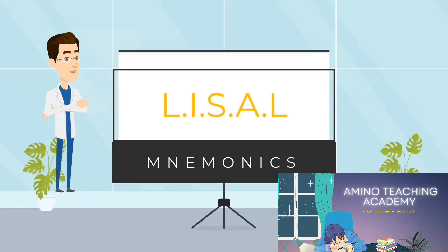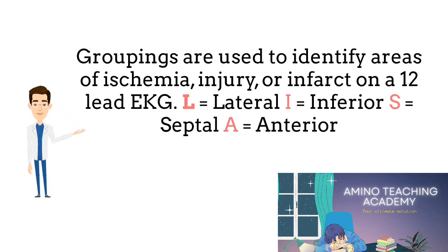LISAL, which is a 5-lettered word. Remember AVR is not included. So we have 11 leads remaining. Groupings are used to identify areas of ischemia, injury, or infarct on a 12-lead EKG. L equals lateral, I equals inferior, S equals septal, A equals anterior.